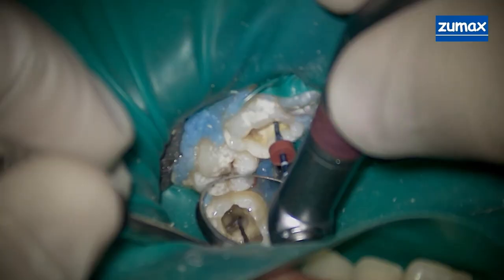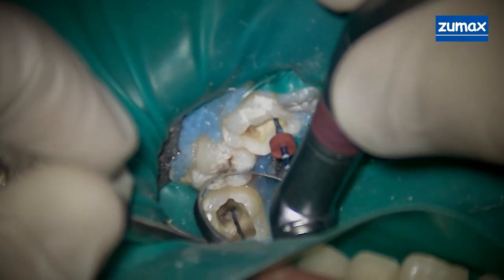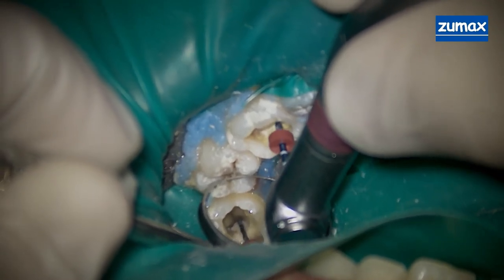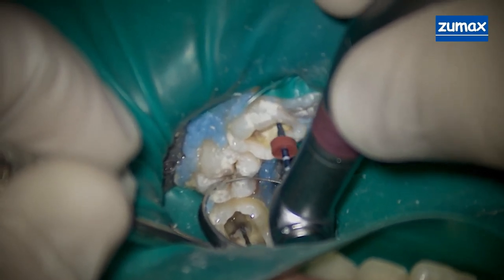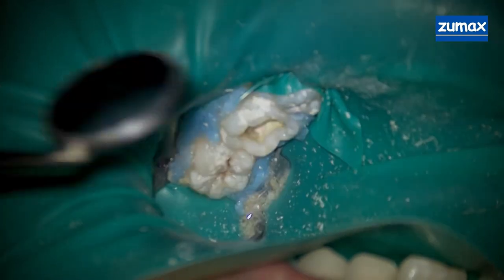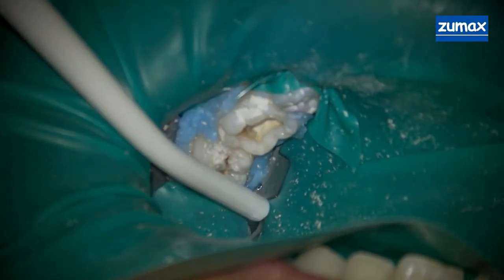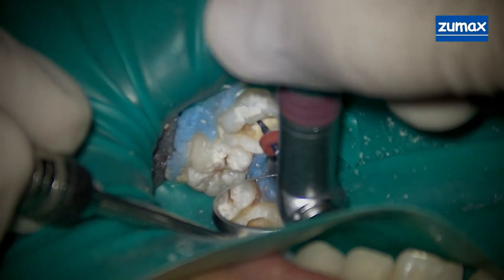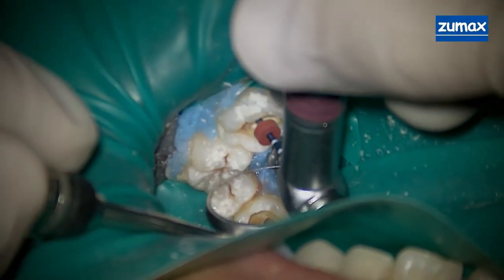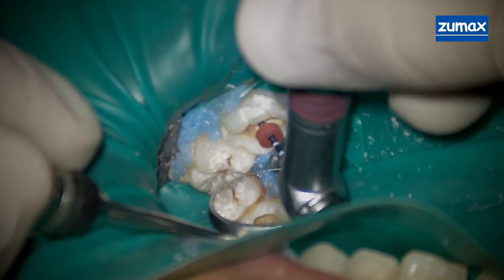As we're going, you'll notice that I take the files out and look at them. What you want to look for to determine your master apical file size is when you're getting that machined dentin on the apical third of the file. That, in combination with the sensation of it getting tighter down the canal, is what you use to determine when you've reached the appropriate file size.